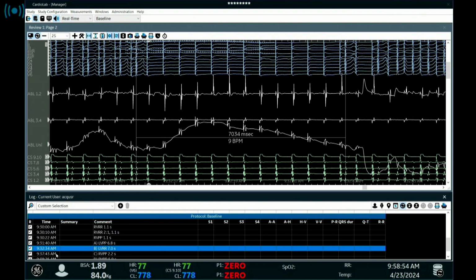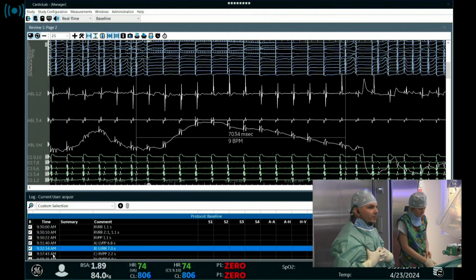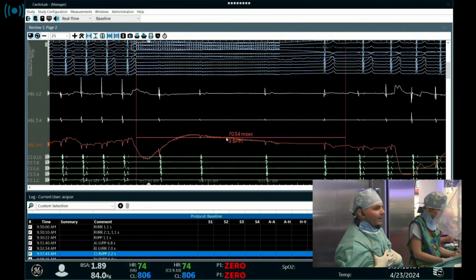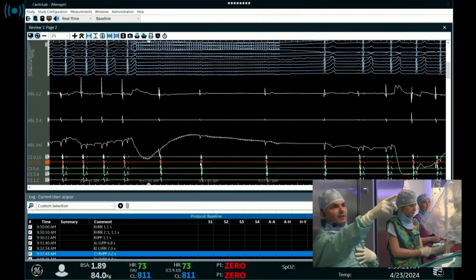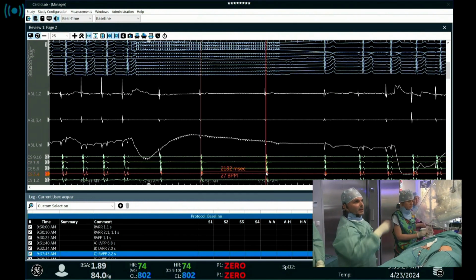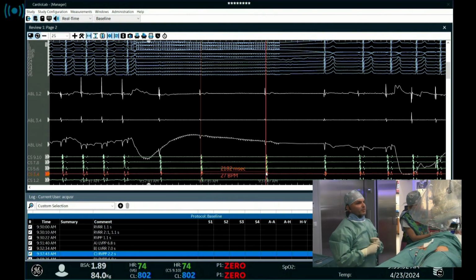Yeah, so we have our angiologist. So now we will show you how we find the vagus nerve, and Anna will show you the typical view of the right vagus nerve. And from this point, as you can see, this is ECVS from the right vagus under ultrasound. So the vagal response was much better than from the higher place.